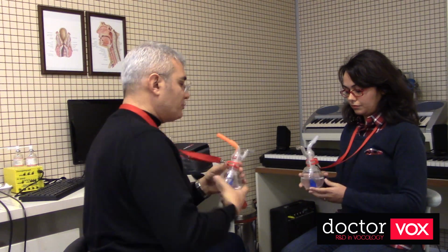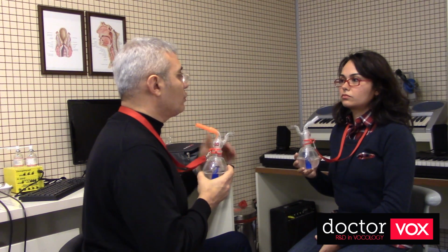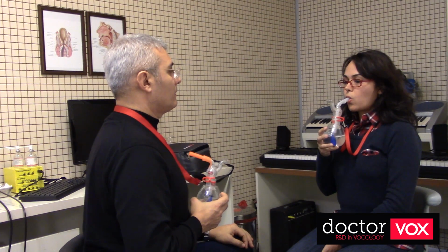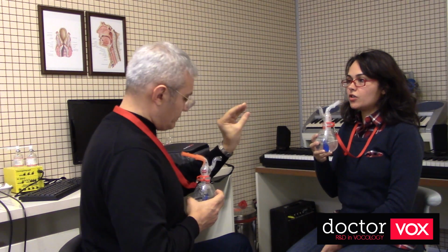So let's do phonating into tube like 1, 2, 3, 4. 1, 2, 3, 4, 5. Like that. Then you can read books aloud into the tube, or newspapers, and do the same maneuver. And the end of the Lax Vox voice therapy technique is to transfer every muscle behavior to conversation or to daily life.